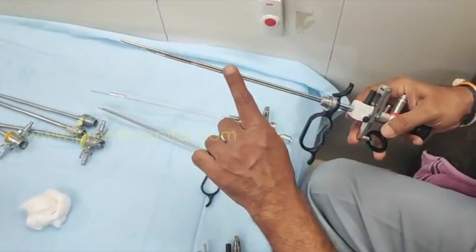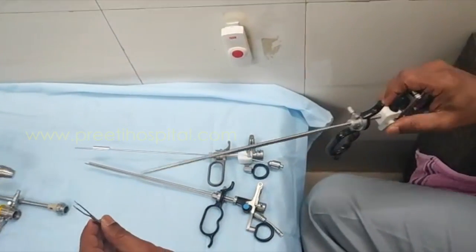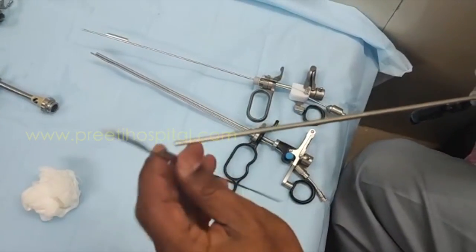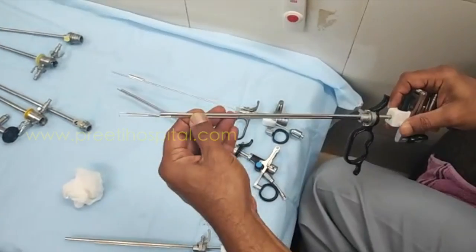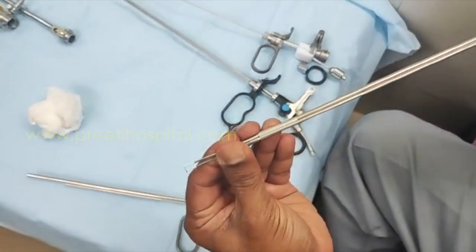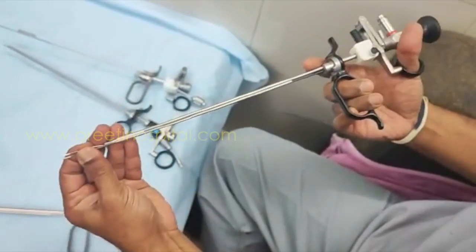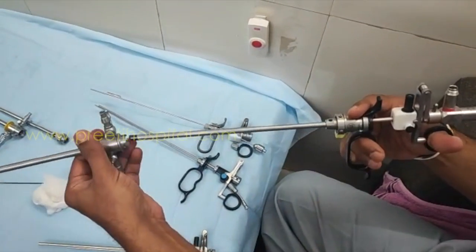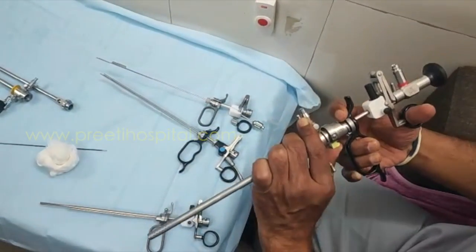You have to use a smaller telescope — 20 or 22 French. This will go here, and for TURP also this can be used where the urethra is very tight. Now this will go in, and the 22 French is this.